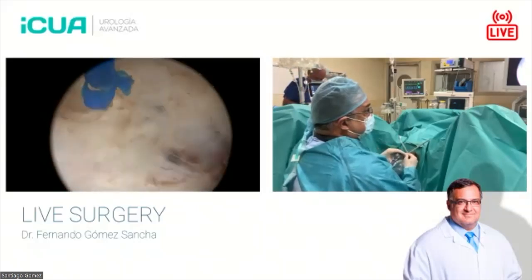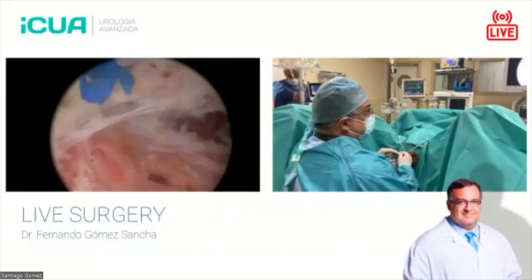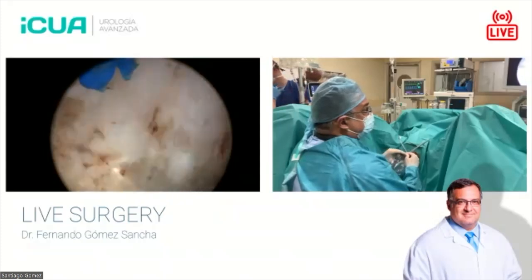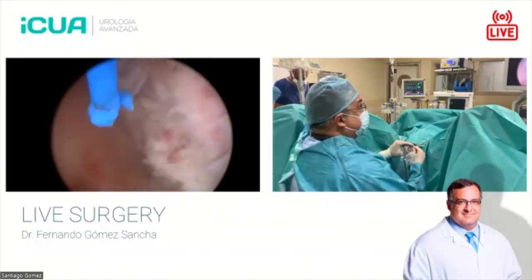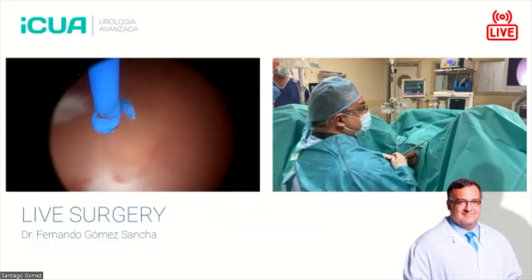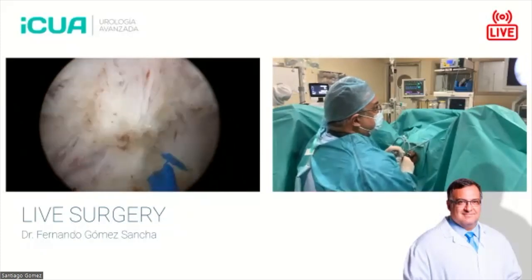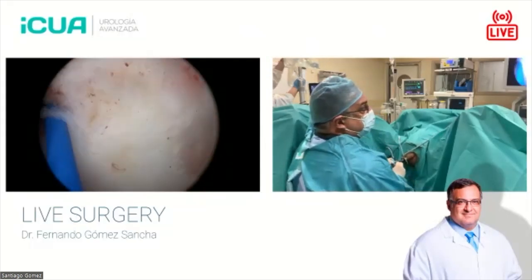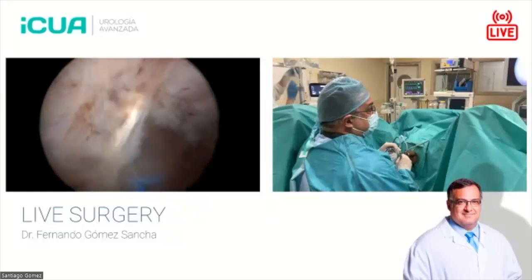And then, as I said before, many people think that with EnBloc, you cannot push the adenoma into the bladder. So what I do, and this allows me to do EnBloc in huge glands also, not only the smaller ones, is this. Let's see if this is free, or mostly free. Instead of pushing this lobe in that direction, I will push the lobe in this direction, so the adenoma goes into the bladder on the side, in a rotational movement. I started the rotation by pushing this lobe, and I continue the rotation by pushing in this direction, so that the adenoma rotates. It's like the head of a fetus going through the birth canal. This is the same idea.